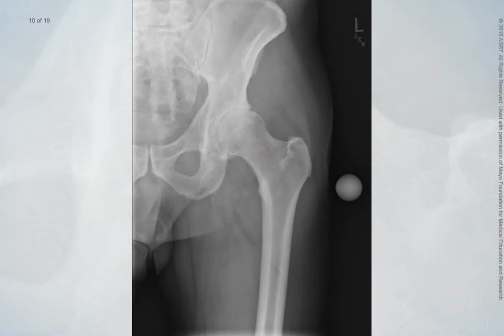The long axis of the femoral neck is demonstrated without foreshortening, and the greater trochanter is seen in profile. Most or all of the lesser trochanter is not visible beyond the medial border of the femur. Orthopedic devices, when present, are visible in their entirety, and soft tissue and bony trabecular detail is well displayed.